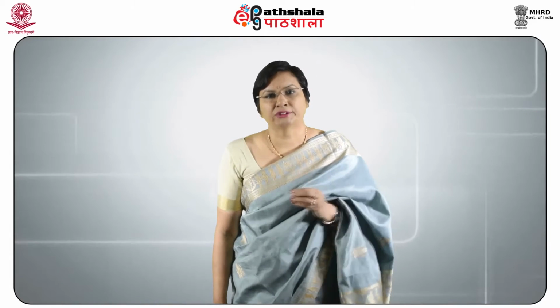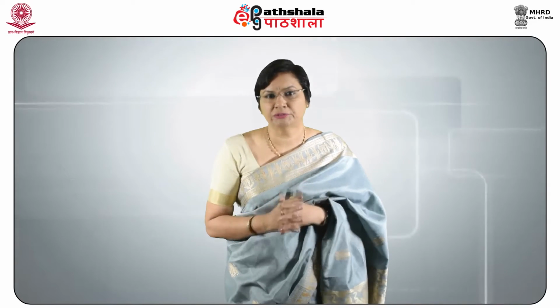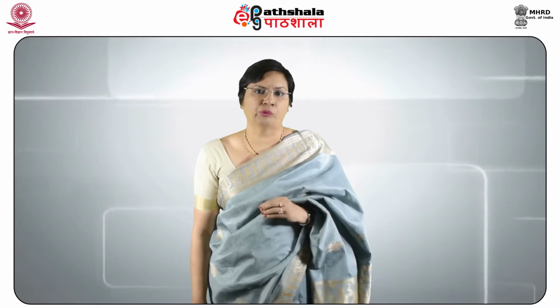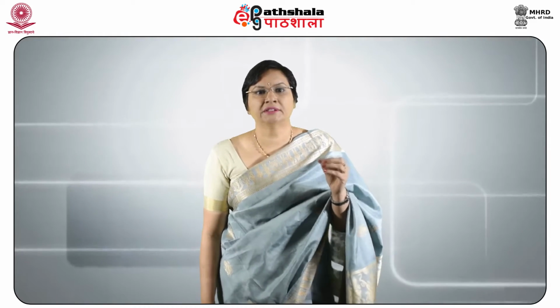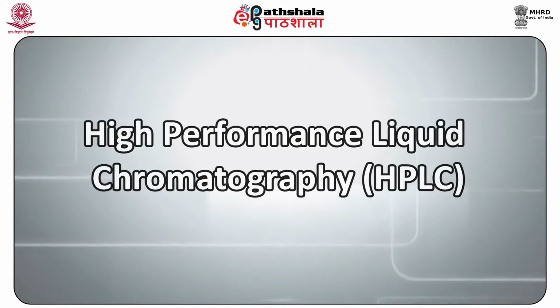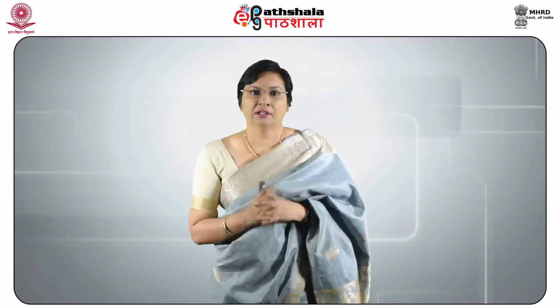This type of gas chromatography is very effective for analysis of gaseous mixtures or of compounds that have a low boiling point. The parameter concerned is the adsorption coefficient. So after this, let us move to the next technique, which is HPLC.